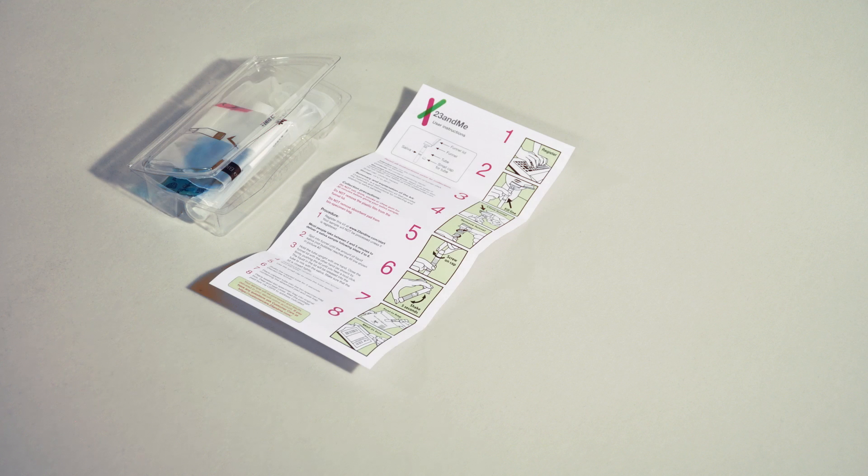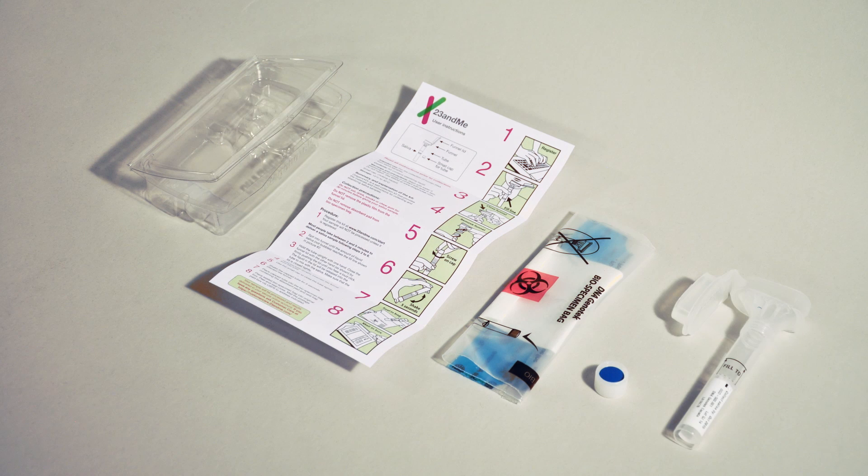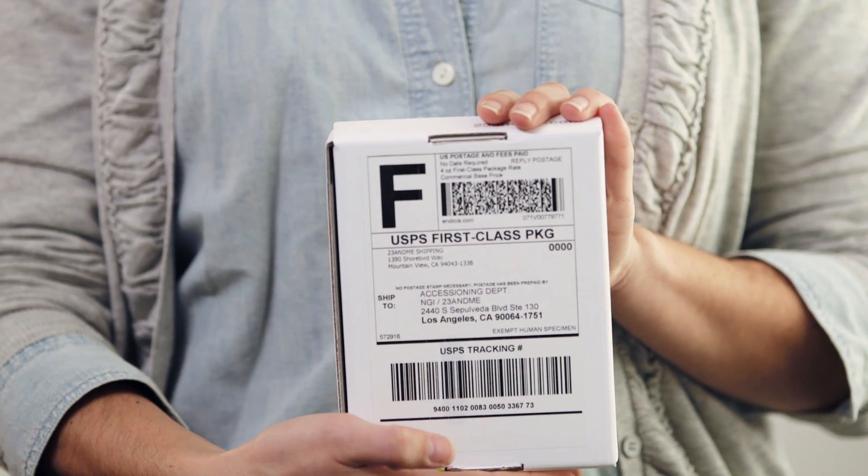Each kit includes the following inside the plastic clamshell: a sheet of instructions, a plastic biohazard bag, a small tube cap, and the sample collection tube with attached funnel cap. You'll also need to hang on to the box your kit was shipped in, since this is the same box you'll use to ship it back to our lab. The prepaid shipping label is on the back of the box.